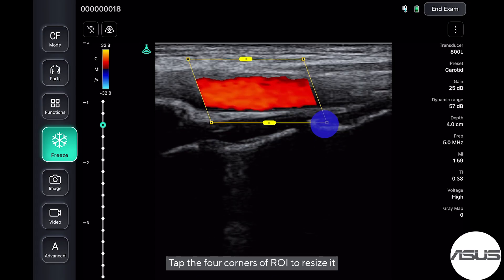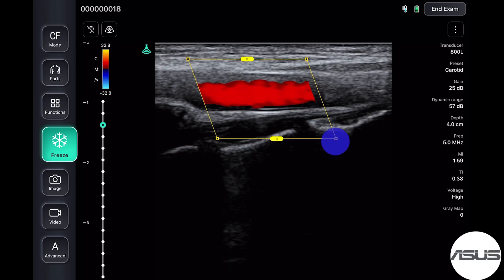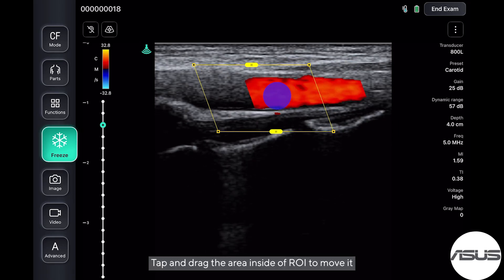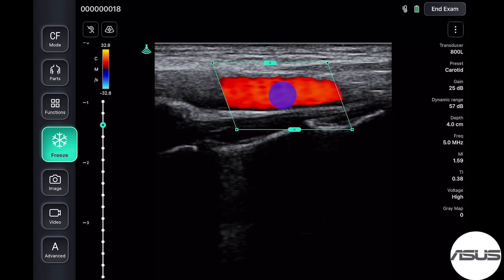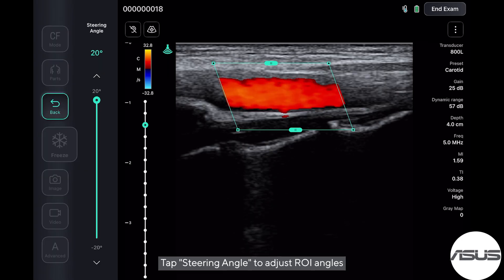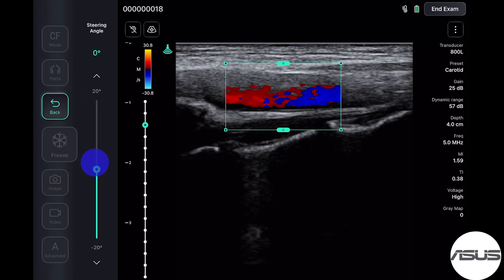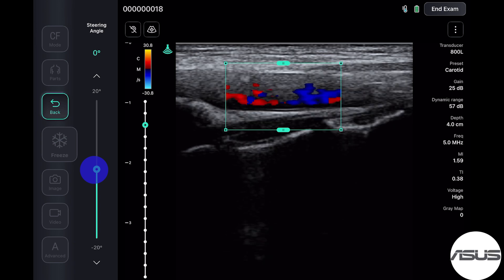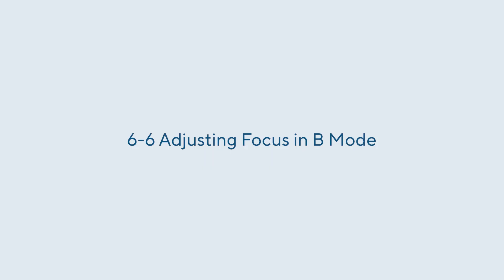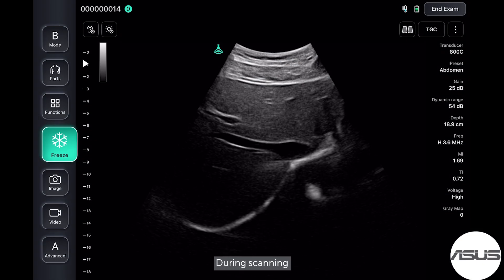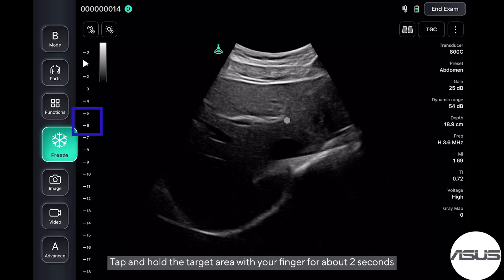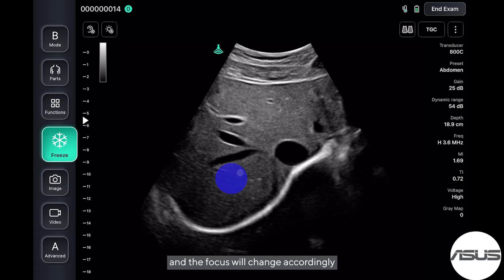Tap the four corners of the ROI to resize it. Tap and drag the area inside the ROI to move it. Tap steering angle to adjust the ROI angles. Tap the target area with your finger for about two seconds, and the focus will change accordingly.